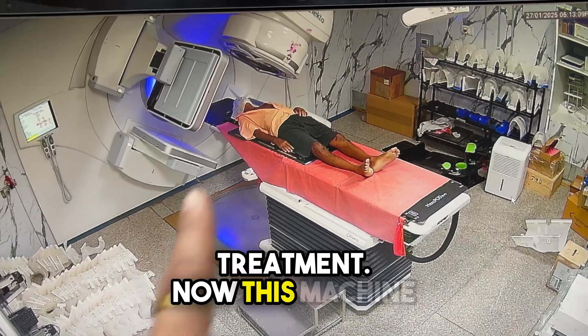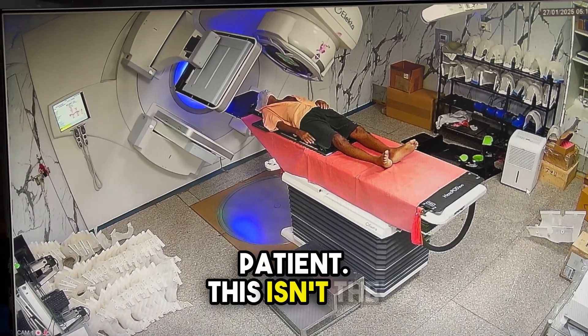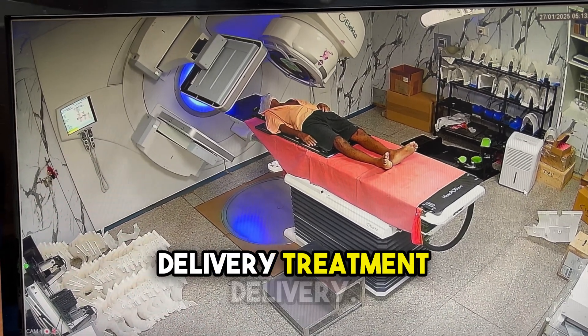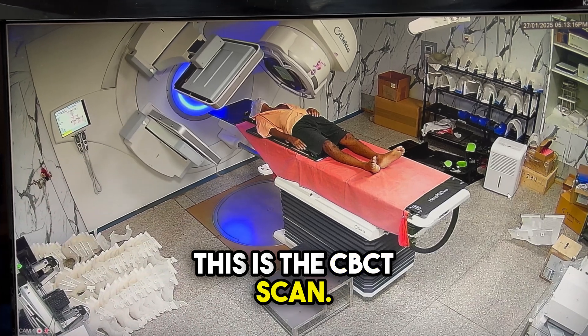Now, this machine here is taking the CBCT scan of the patient. This is not the treatment delivery — this is the CBCT scan.